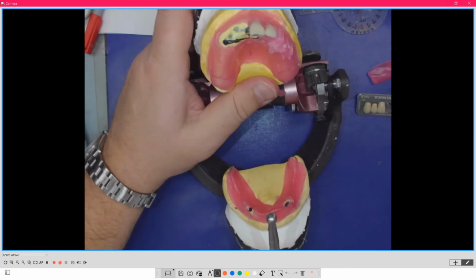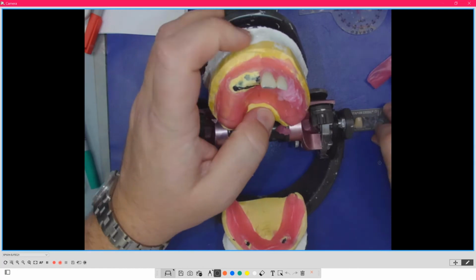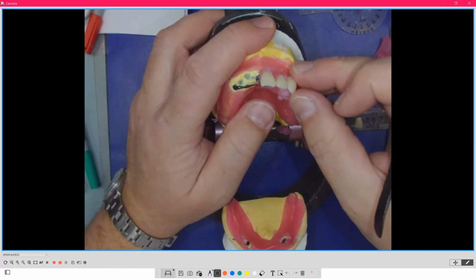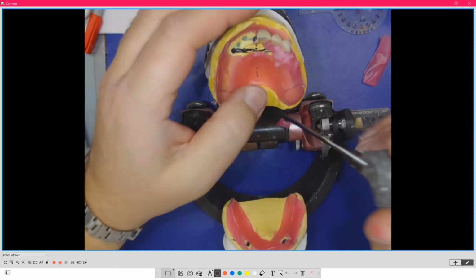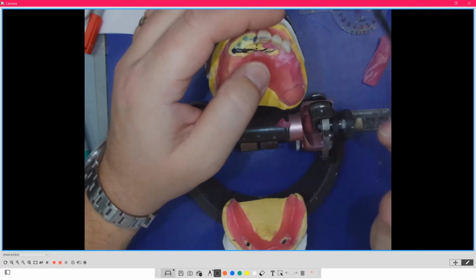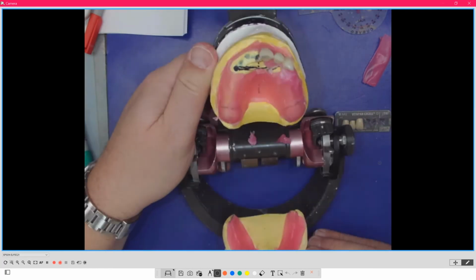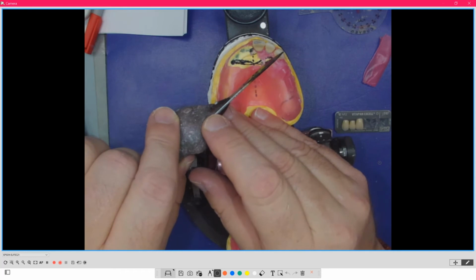Okay, so I've set the lateral, and now I'm going to set the cuspid. And then again, what am I looking for when I set the cuspid? Is I am looking to see if the long branch rugae is pointing towards the cuspid. So let's make sure that it is. So I'm going to take a little bit of this away. Just to, again, so I apologize, things are going to move a little bit, but I'm doing that specifically just to exaggerate the point here of when you set the teeth and you come up, that long branch rugae should be pointing towards the center-ish of that cuspid.